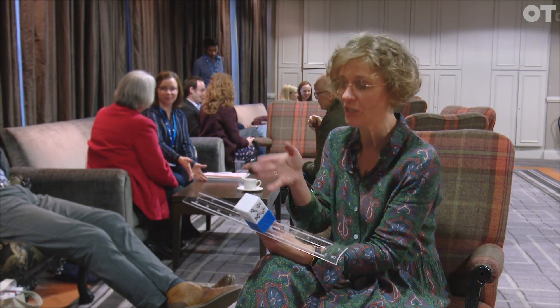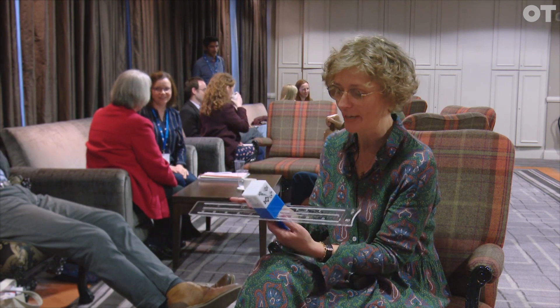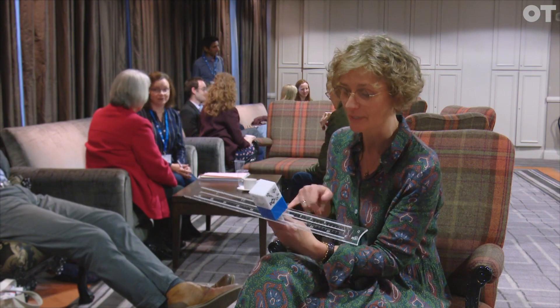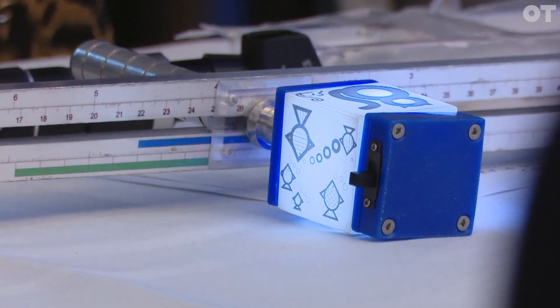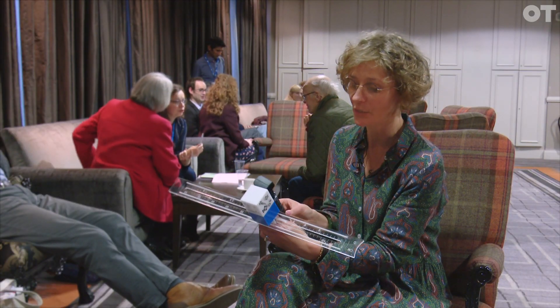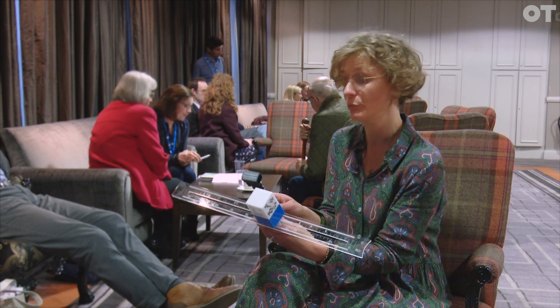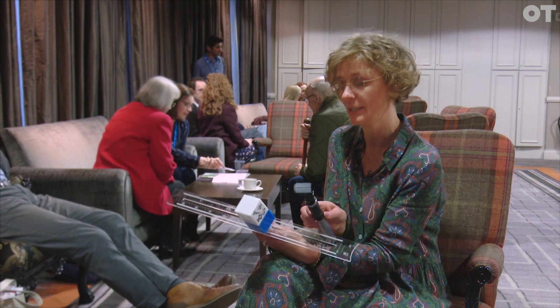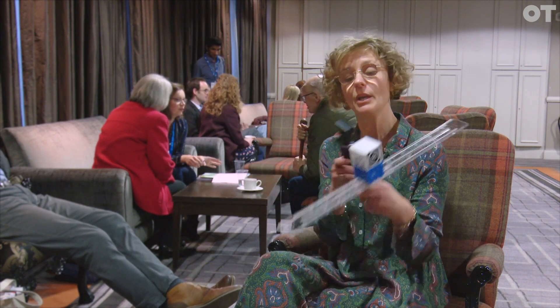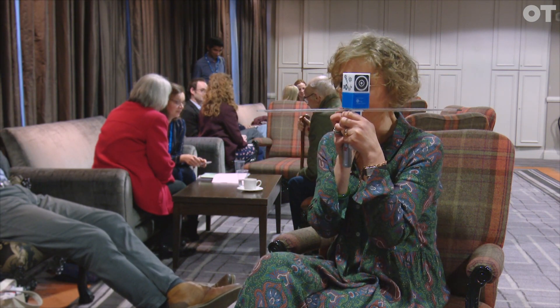In a visually normal, typically developing school child you would expect a normal range. If I set this target at four diopters, or 25 centimetres, most children will have a normal range within this area marked on the ruler. So I know that if I see neutral within that normal band marked on the ruler, it's normal. If I have to go beyond the band, that's not a normal response - which makes it really quick for me to just look down at the ruler while looking at the child's reflex.